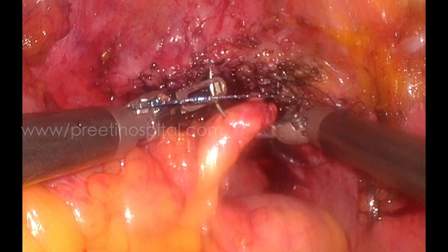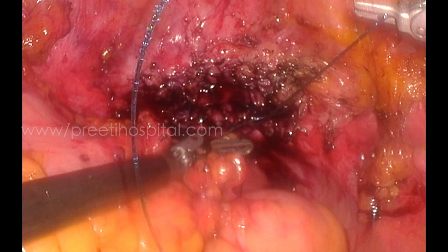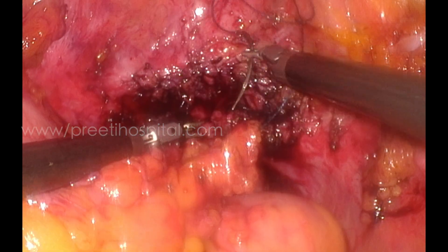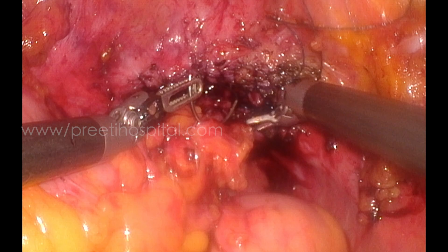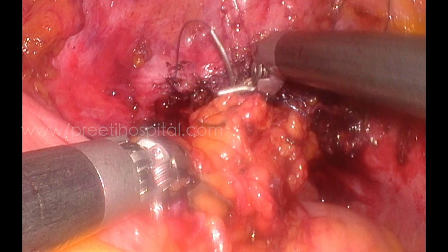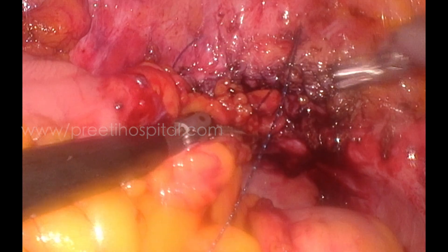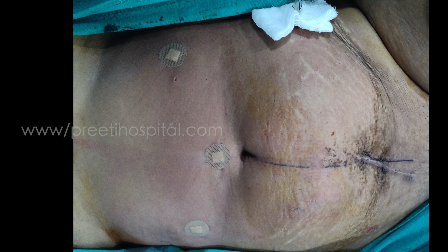We distended the bladder and checked for any leak — there was absolutely no leak. We put in 100 ml; usually in this type of repair even 15 ml will make a leak obviously evident. Before closing we placed the omentum, which is attached to the sigmoid colon, so that only the vaginal edge is completely covered. Under direct vision I could take nice bites and suture the fat and peritoneum onto it. This is the last bite — the vaginal suture line is not seen, meaning the fat is adequately covering it.